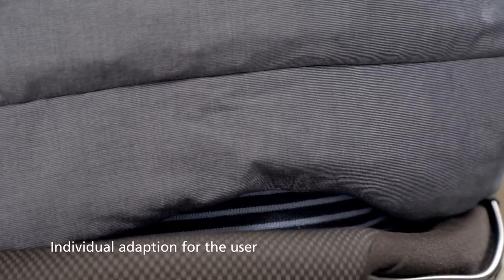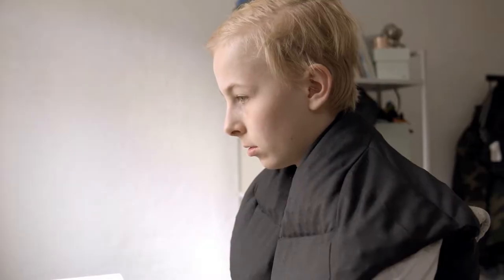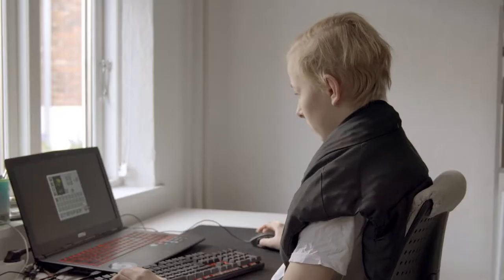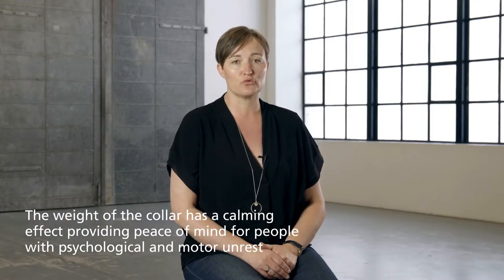Sense On is designed to be discreet and comfortable to wear and can be used for both relaxation and activities. The weight of the collar has a calming effect, providing peace of mind for people with psychological and motor unrest.